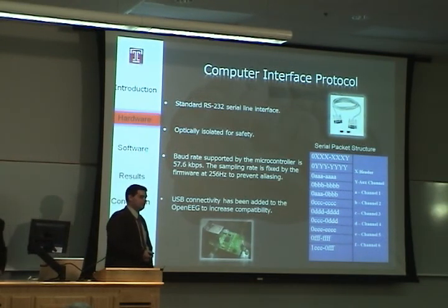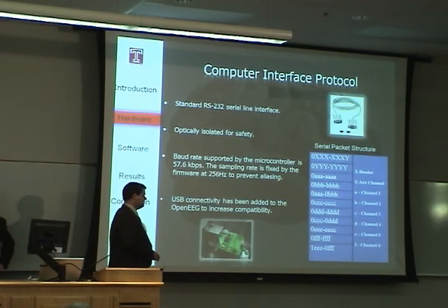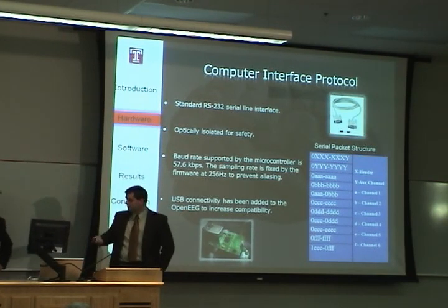The second design modification we made was the addition of USB connectivity, and this was necessary just to ensure compatibility with all modern computers. Now, once the signal gets into the computer, it is then processed by our software, and to talk more about software, I will turn it over to Jesse.